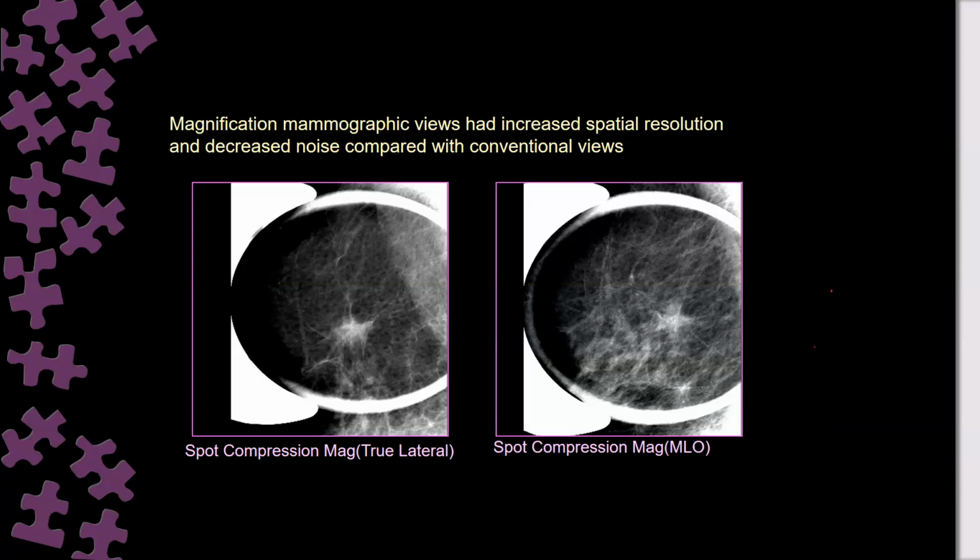The difference is in the view. This is, as written, MLO, and this is lateral, true lateral. Sarah? Yes. You said this is true lateral view?